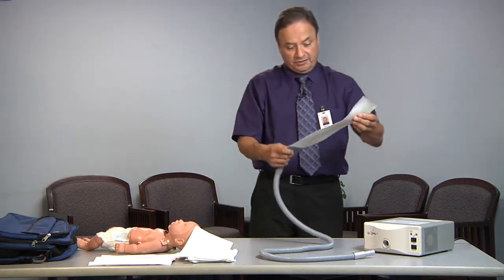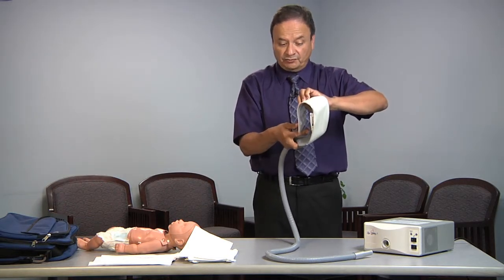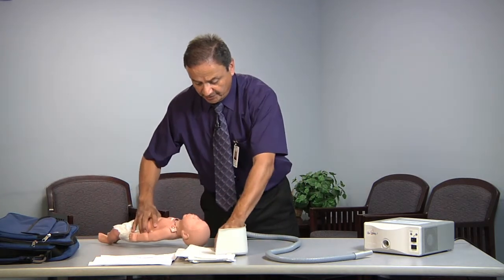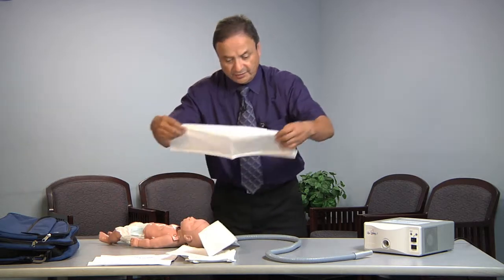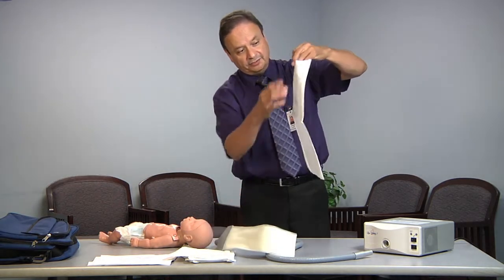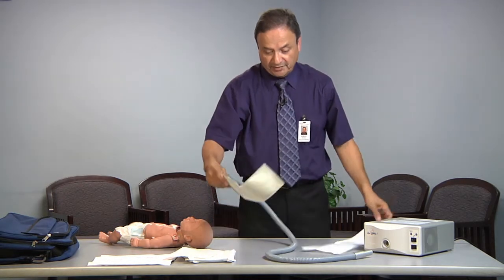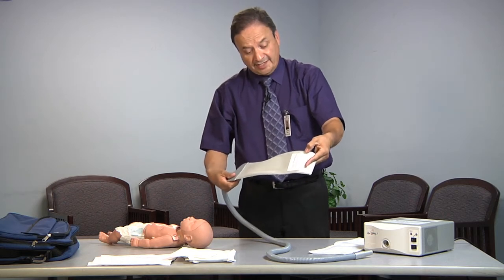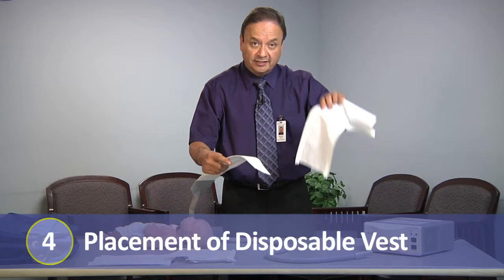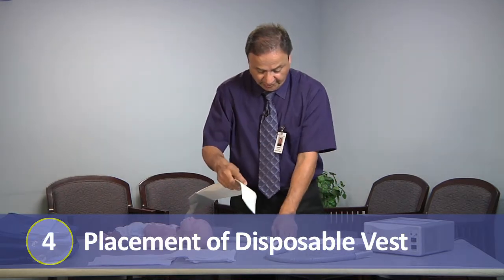Okay, this pad is unique because it's actually called a wraparound, and it wraps around the baby. So it's kind of a loose wraparound, but it fits right around the baby. The best thing to do on this is, they're called pads, so it slides right through. This pad has a darker side and a lighter side, writing on one side and the smooth side on the other. So always remember to put the smooth side through the lighter side of the pad itself. We're going to go ahead and slide it on through.